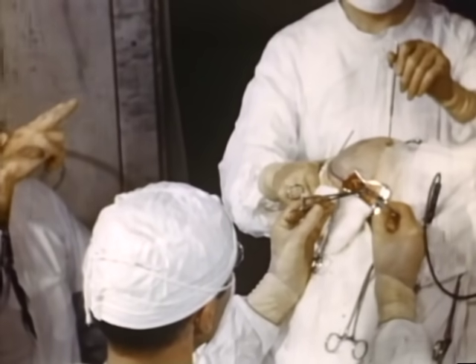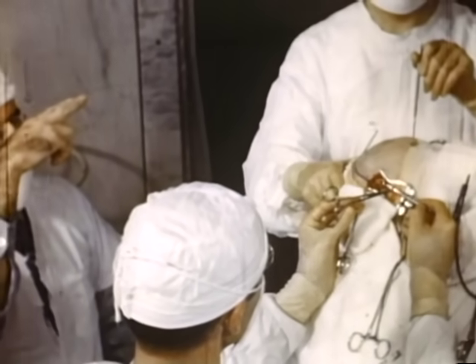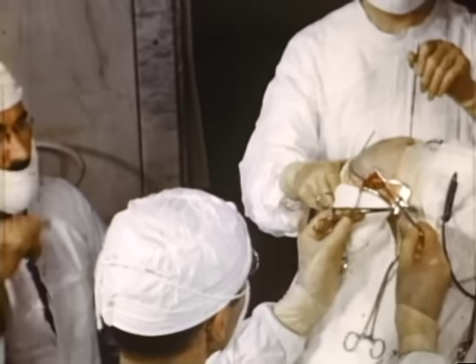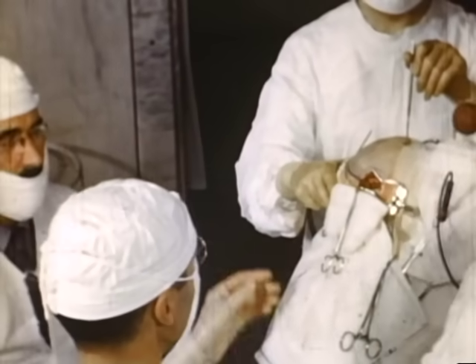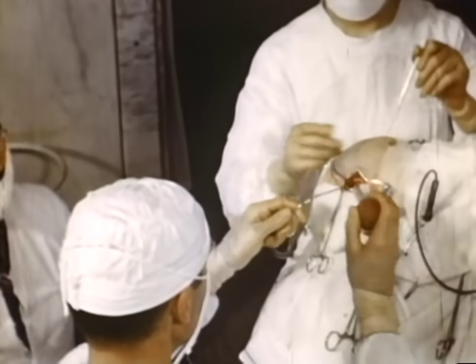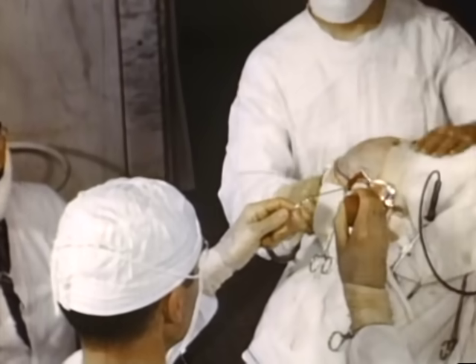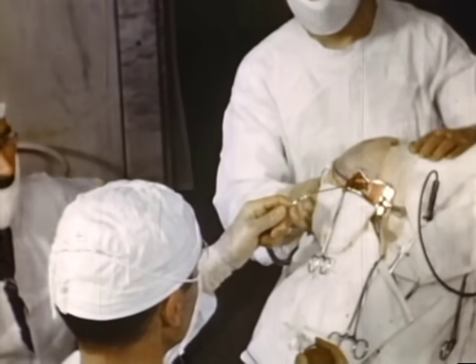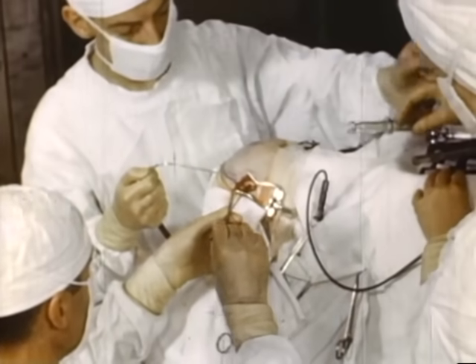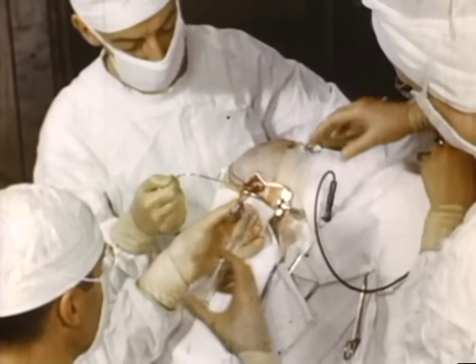Still guided by the neurologist, the surgeon cuts the upper quadrant in the same way, always maintaining the instrument in the plane of the coronal suture. It seems to be of little importance whether or not the ventricle is entered. The incisions are irrigated with normal saline in order to control hemorrhage. Usually there is very little bleeding, most of this coming from the superficial cortical vessels.